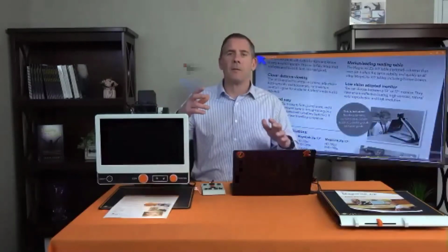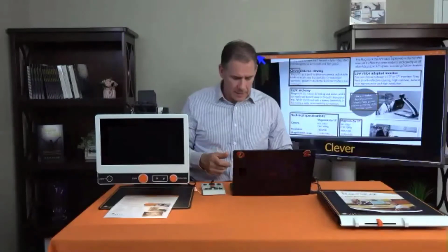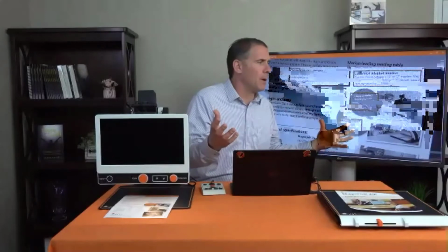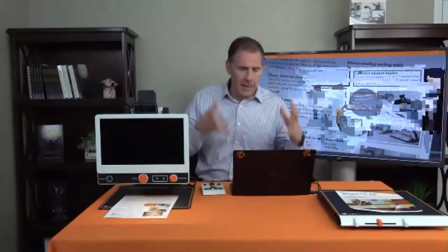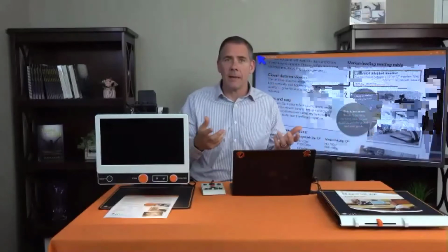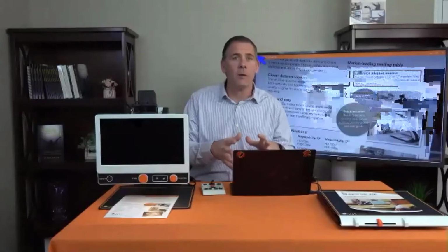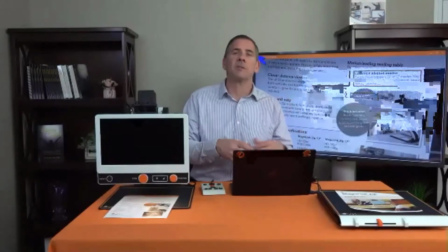I could rotate the camera, and then I could jump back over to the OCR view, back and forth. So I don't mean to be confusing, but what I love about this is I'm in live mode with the touch of a button. I touch that button, now I'm in camera, I'm in an OCR mode. So anything I had scanned, I could just start reading again. I could manipulate the text. I could save the text. I could export the text. There's so many things we could do, but I don't want to go into that today. We'll do that in next week's webinar, the software side of this.